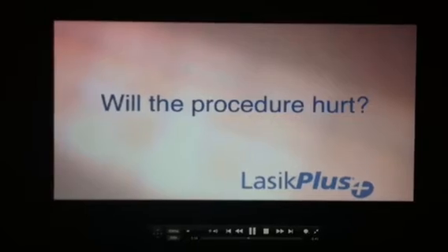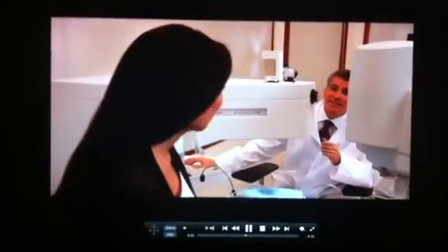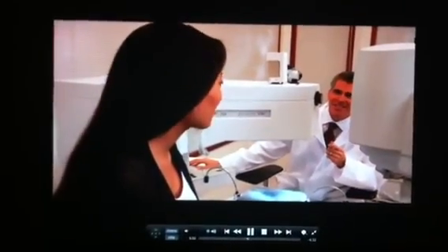Will the procedure hurt? The LASIK procedure itself is not painful. You may experience some minor discomfort for a few hours after the procedure. It may feel like your contacts have been in a little too long.